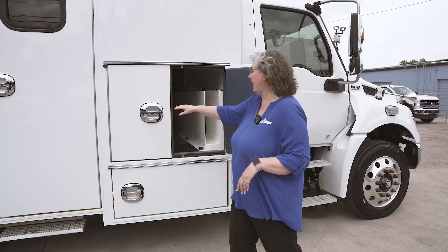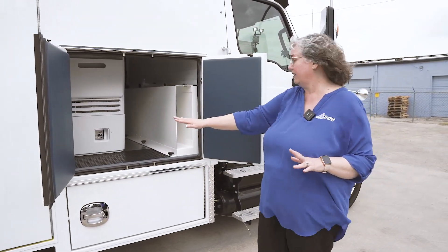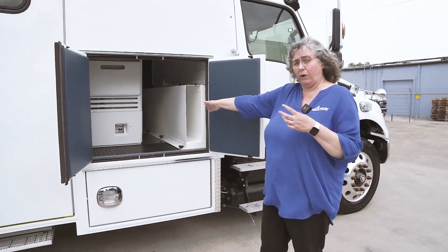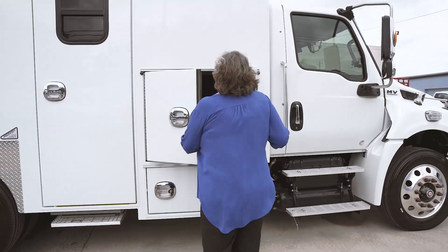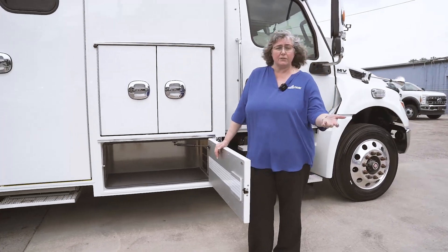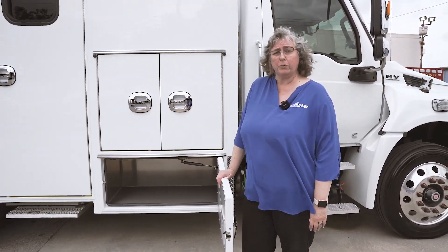On this side, we added two access doors, giving you access to the scanner for anything that needs to be done mechanically. You also get a backboard storage compartment — you can put a scoop and two backboards into this compartment for easy access at curbside. Additionally, we have another storage compartment down here that we didn't have before. The luxury of the 15-foot unit is you get extra curbside storage, great for tight city spaces where you can put frequently used items.